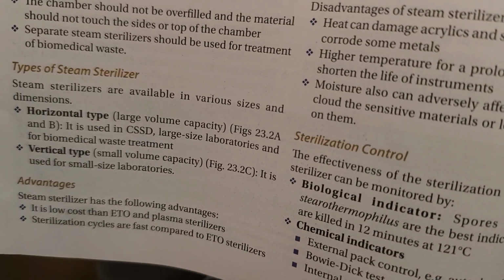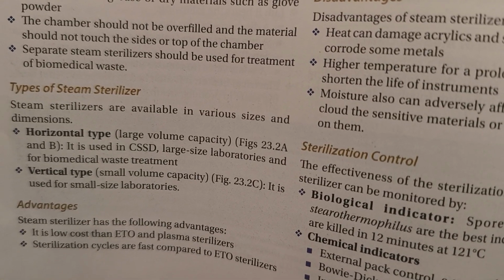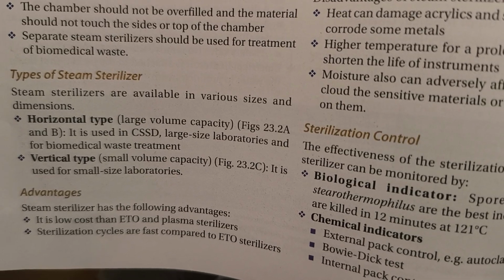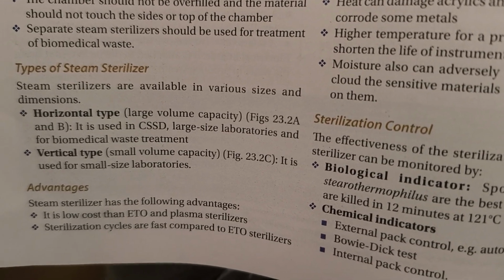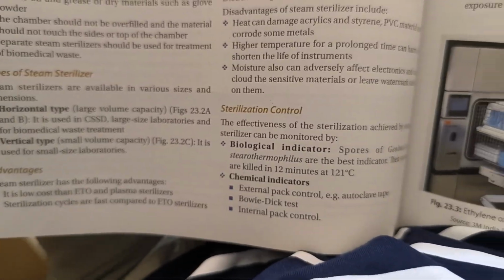Types of steam sterilizers. Steam sterilizers are available in various sizes and dimensions. Horizontal type, large volume capacity, figure 23.2a.